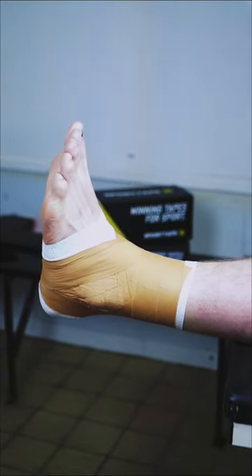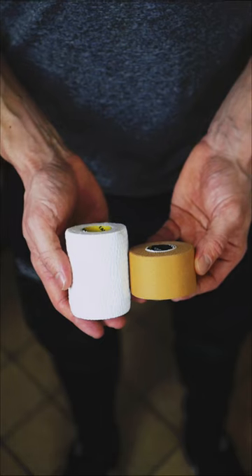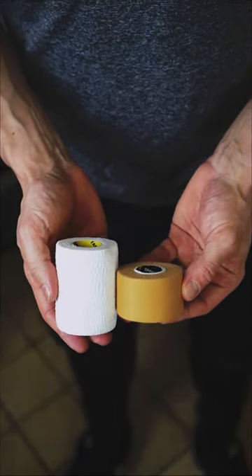Here's Cardiff Rugby Physio Ben Warburton's guide on how to tape an ankle in just 60 seconds and using only two tapes: tearable EAB and Zinc Oxide tape.